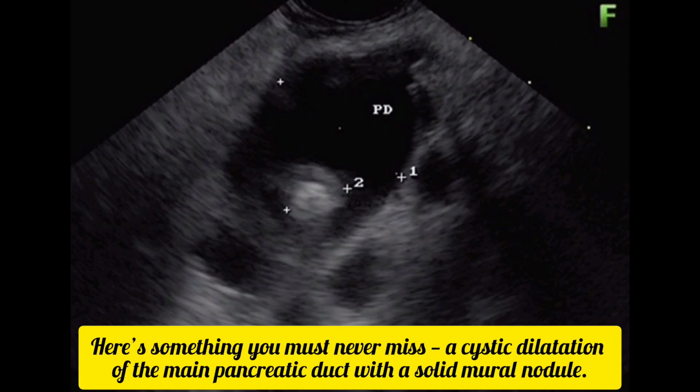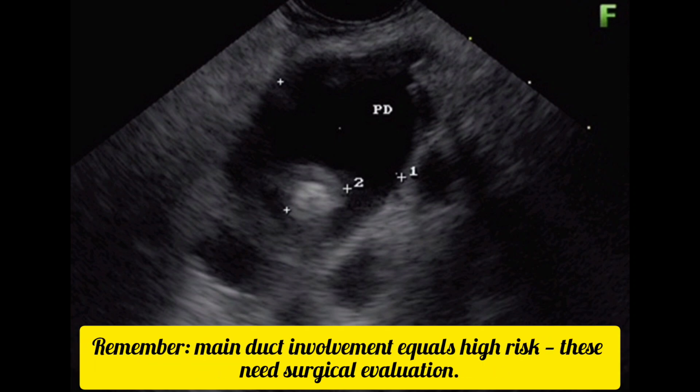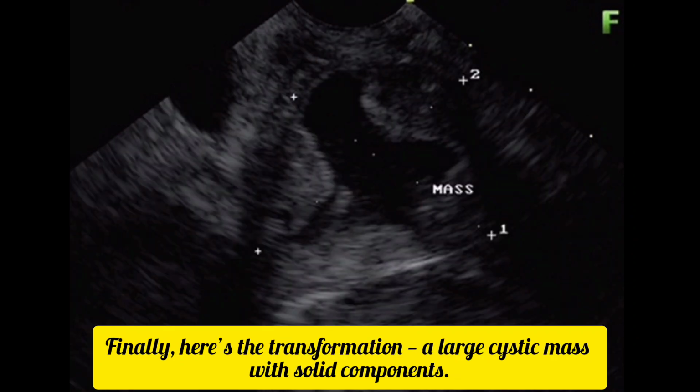Here's something you must never miss. A cystic dilatation of the main pancreatic duct with a solid mural nodule. The aspirate showed high mucin content and atypical mitotic cells, confirming main duct IPMN. Remember, main duct involvement equals high risk. These need surgical evaluation.